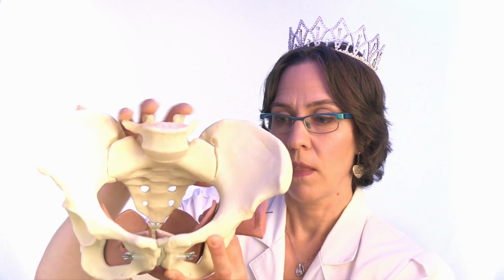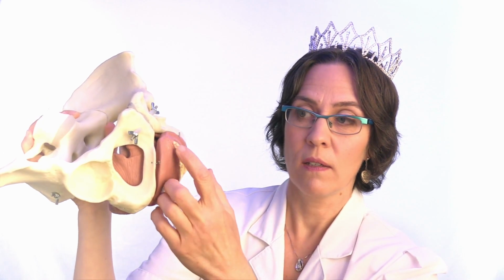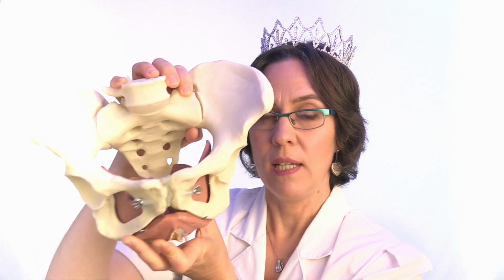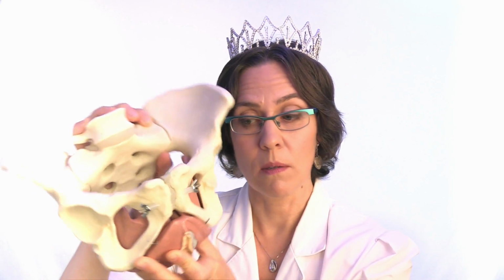Another thing you really need to succeed with a pessary is that the tone of your pelvic floor muscles needs to be good. Your pelvic floor, we're missing a layer of it here. So here's your pelvis, right? Here's the pubic bone just to get you oriented. Here's the outer layer of the pelvic floor, which is this bowl of muscle here. There's the vagina. There's the clitoris, the urethral opening. This bowl of muscle here needs to be functioning properly in order to help hold the pessary in place. The pelvic floor is a big part of what supports the pessary in position inside your body. So if the pelvic floor isn't toned properly, the pessary is probably not going to work well.